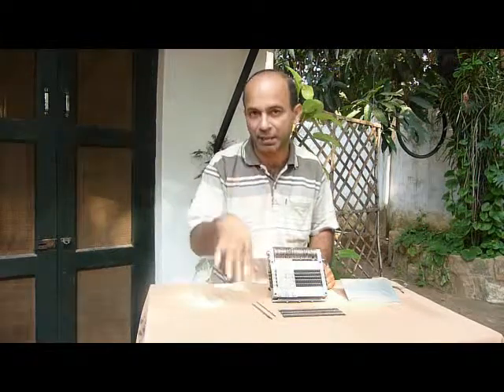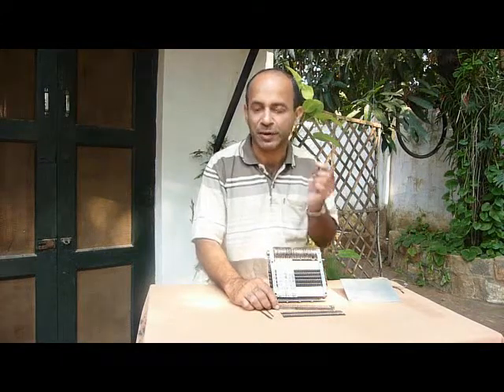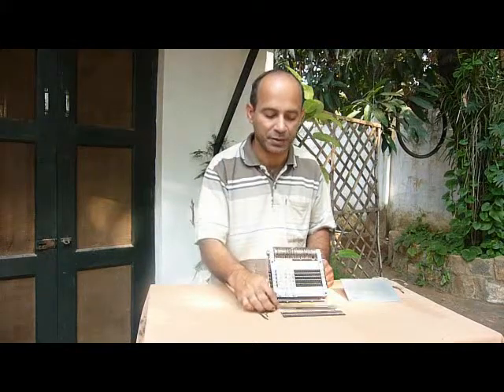The ones that are closed, the wedges have no effect because the wedges are basically made out of little springs. And so if the column slides are closed, they can't lift the pin, then the springs buckle. It's a tiny little spring and it's got a profile that is designed to either kick up or allow the pin to rest in its position. So that it will be visible in the drawing.